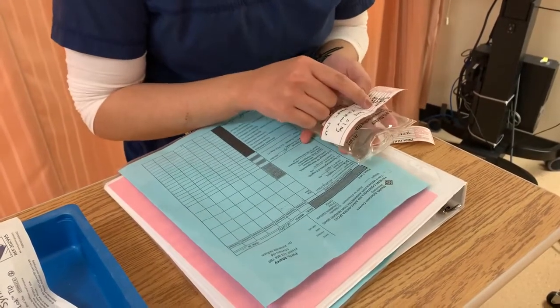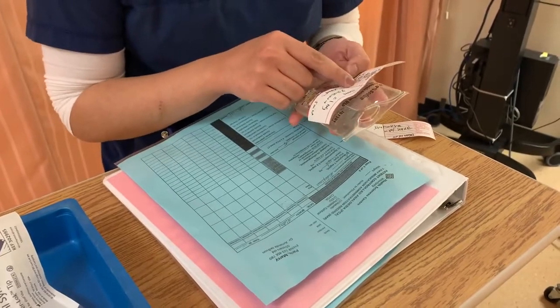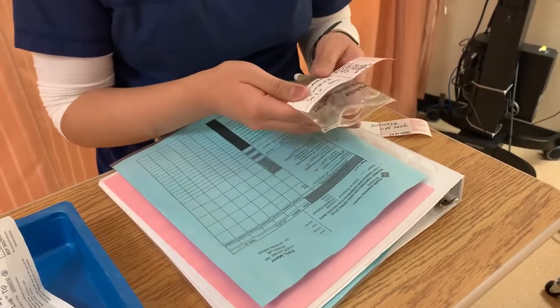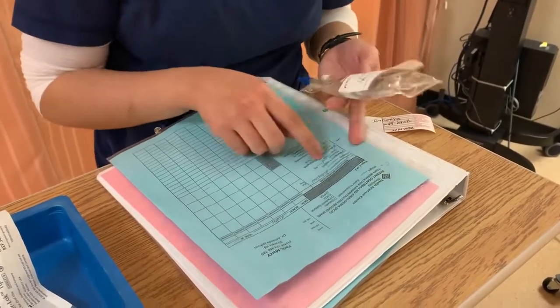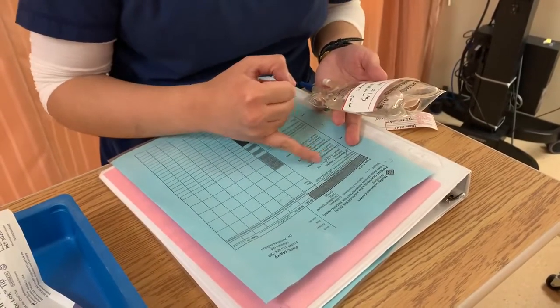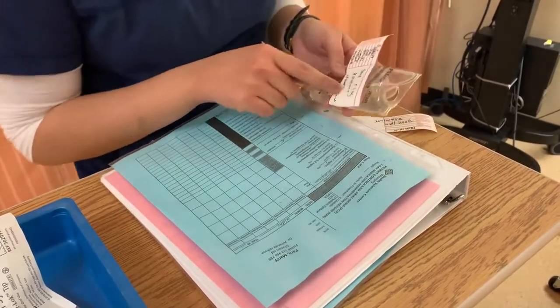And we got 50 milligrams in here. Volume is 5 mLs. And the diluent is 45 mLs normal saline. There is a 50 ml total volume in here, which means we have a concentration of 1 milligram per ml, and that is exactly what we need here, so that is the right dose. The patient's dose bolus would be 1 milligram as ordered by the doctor, and we also made sure that we wrote that in here as well in our label.